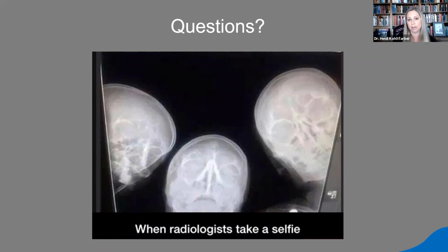Yeah, I reviewed everything. Just to make you feel better, the people that are getting in trouble legally are not the people that took the scan. It's the people that didn't take the scan. And that's the legal arena that we're seeing, at least here in California, which is one of the most litigious states. If something goes wrong and there's not a CBCT, that's what the lawyers are choosing to harp on, the fact that the CBCT was not taken.